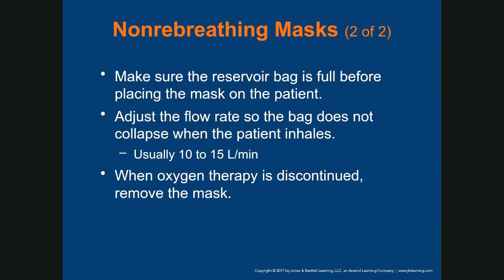Why would I need to do that if it's a non-rebreather? Who can answer that question? Miss Jackson, still having connection problems? Miss Nesbeth, why do I need to take the non-rebreather off before turning off the oxygen?